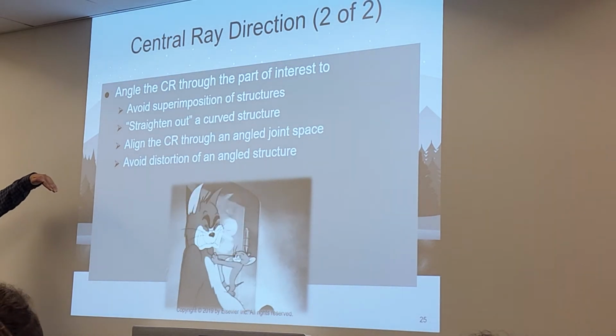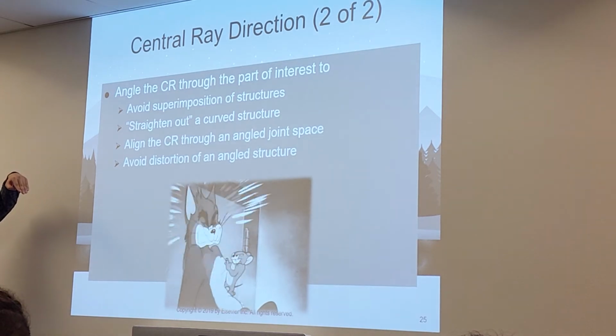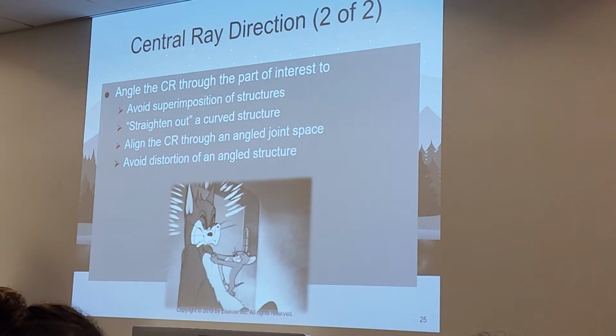The bones of the foot kind of angle like this. So if I want to get these bones looking straight, I also need to throw on an angle for my foot. So those are some examples of when you would want to use an angle with your central ray.